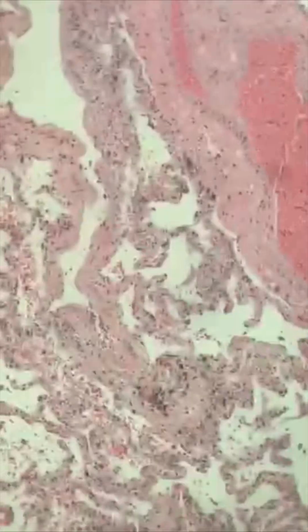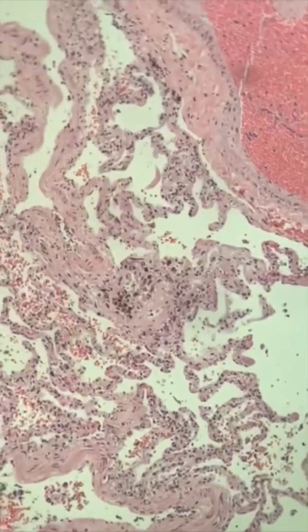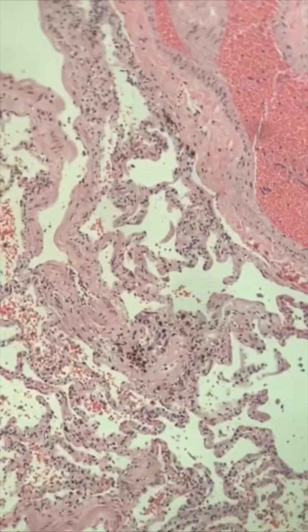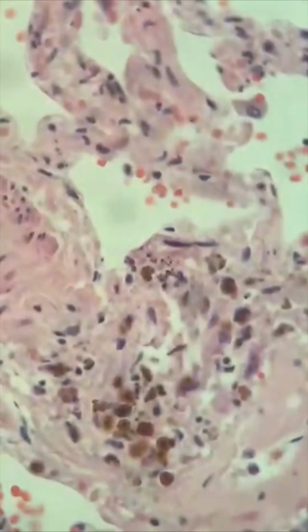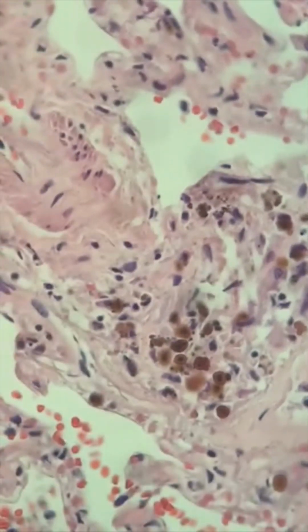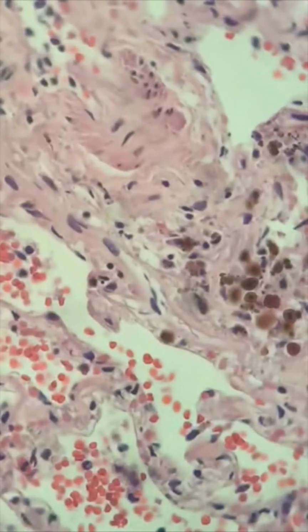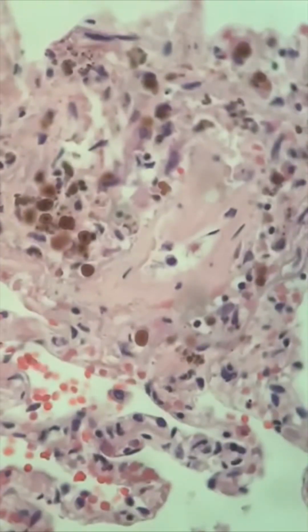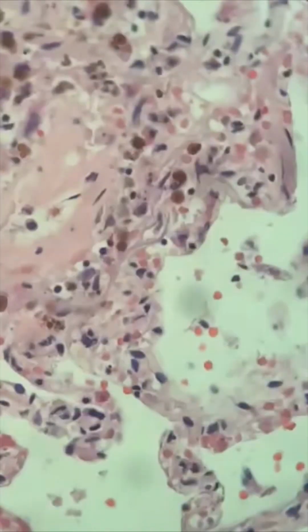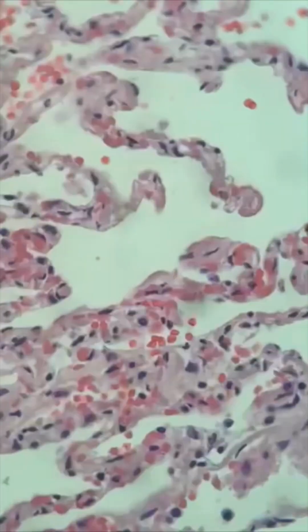But I'm going to show you how we determine if it's evidence of remote hemorrhage. And there are some areas right there around a blood vessel. We're going to show you the hemosiderin-laden macrophages. This is evidence of old hemorrhage. So obviously we have evidence of recent hemorrhage, and with these pigmented histiocytes, evidence of remote hemorrhage. So most of her lung tissue looks like this. Otherwise, it's very aerated, nicely aerated.